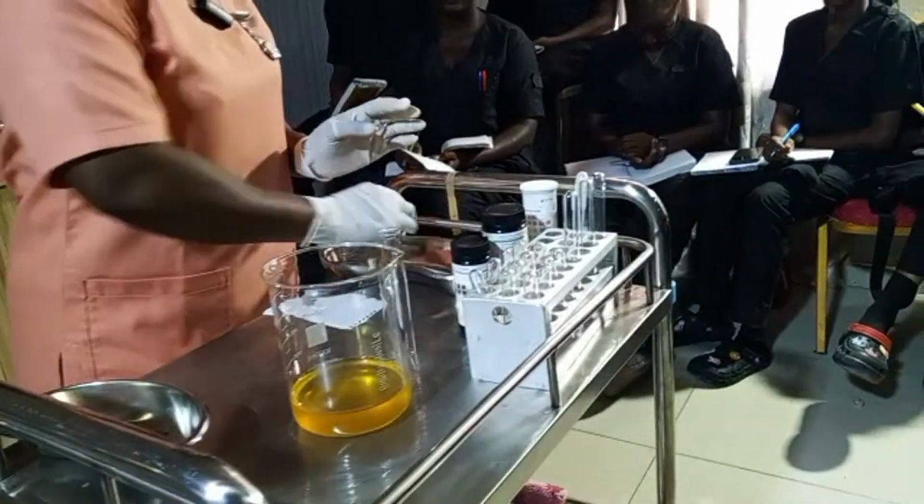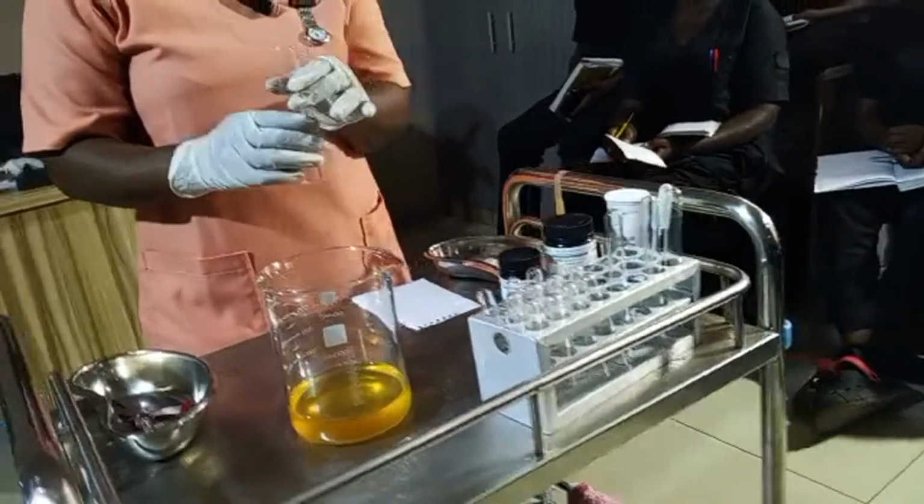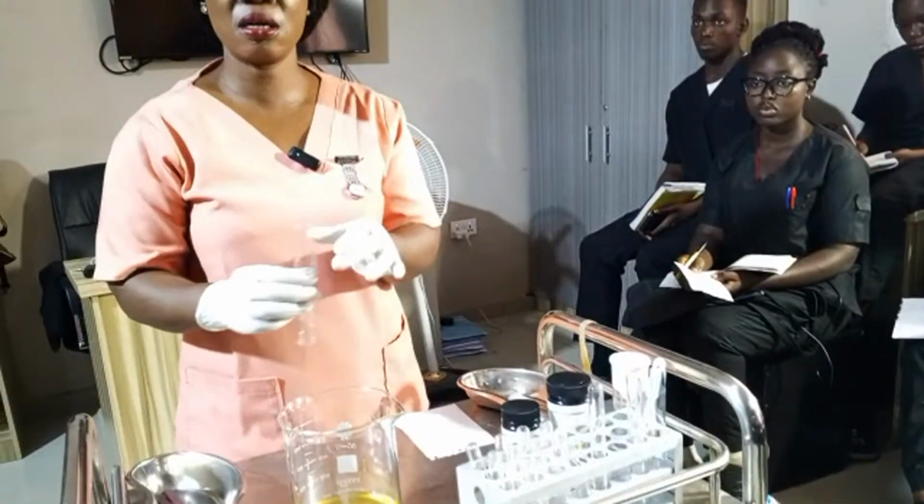Whenever you want to carry out specific gravity of the urine, always know that the test tube has a flat basement and is being placed on a flat surface and is standing properly.